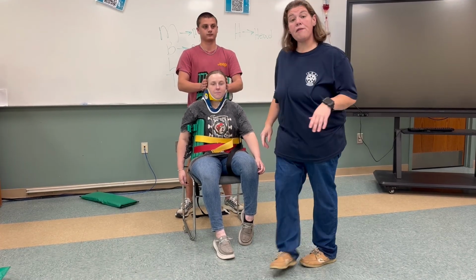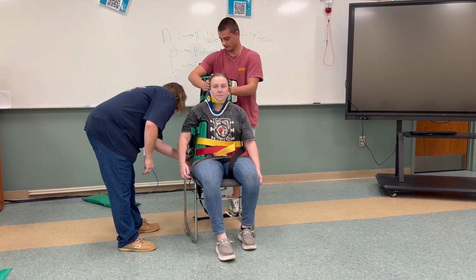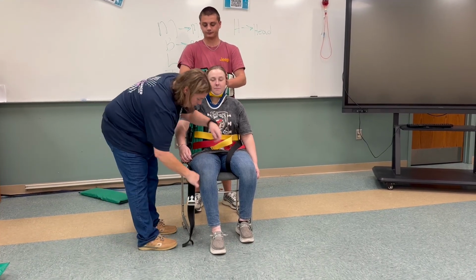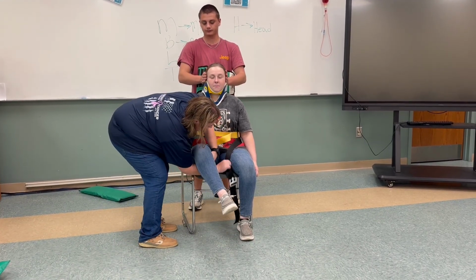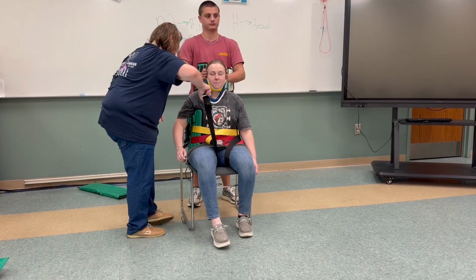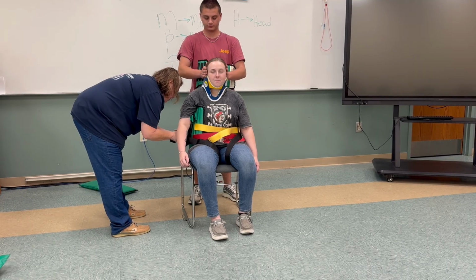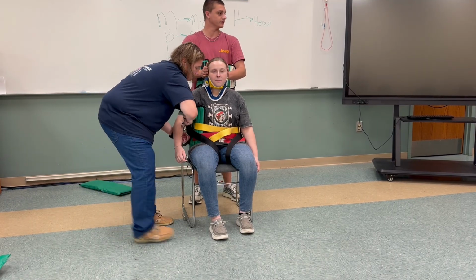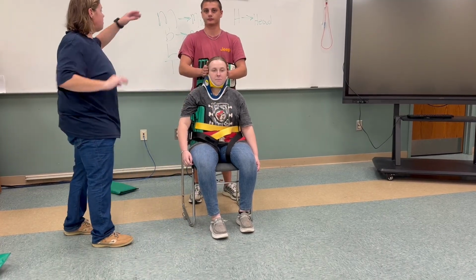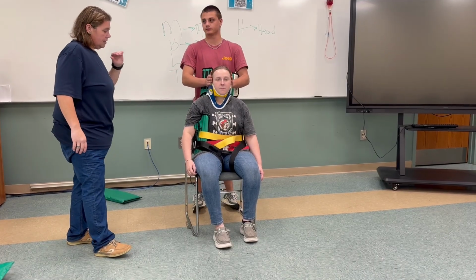All right, we have the first leg. Now you come back and do your second leg. Same exact way as you did the one side. Okay, we're going to go underneath. Back here. And strap. And secure. All right, so if you look at the mnemonic behind Mr. Aiden, we have middle, bottom, legs.